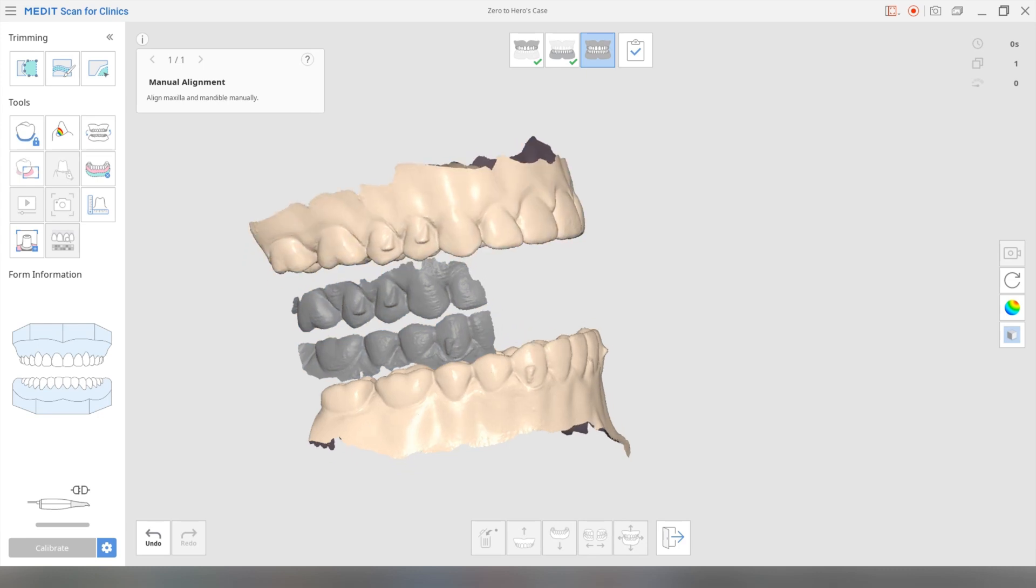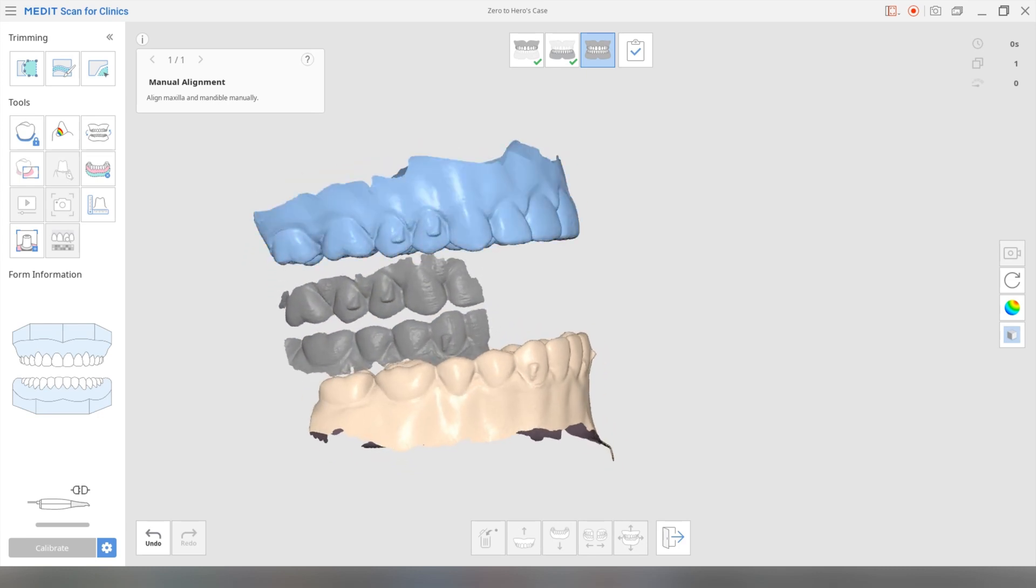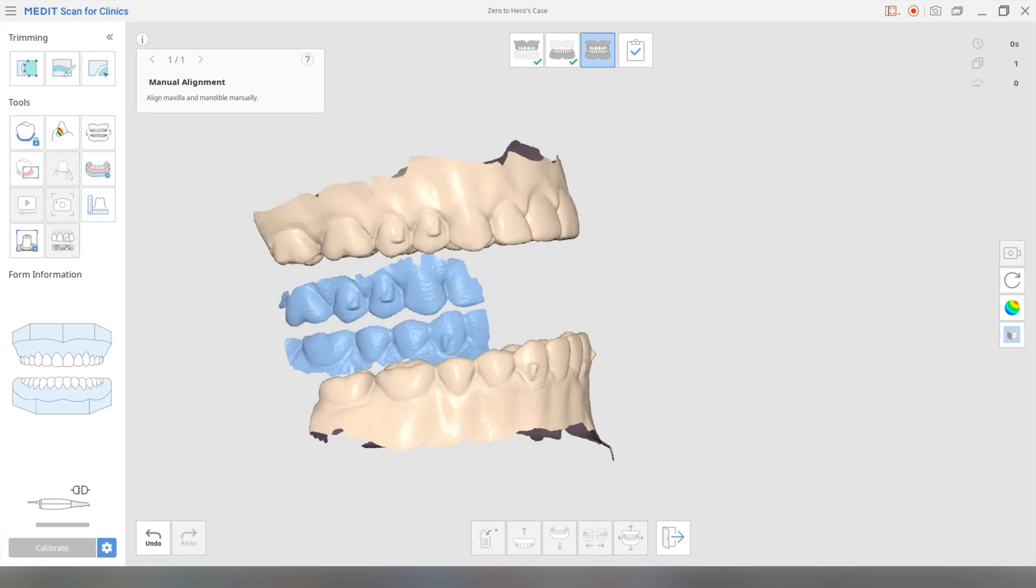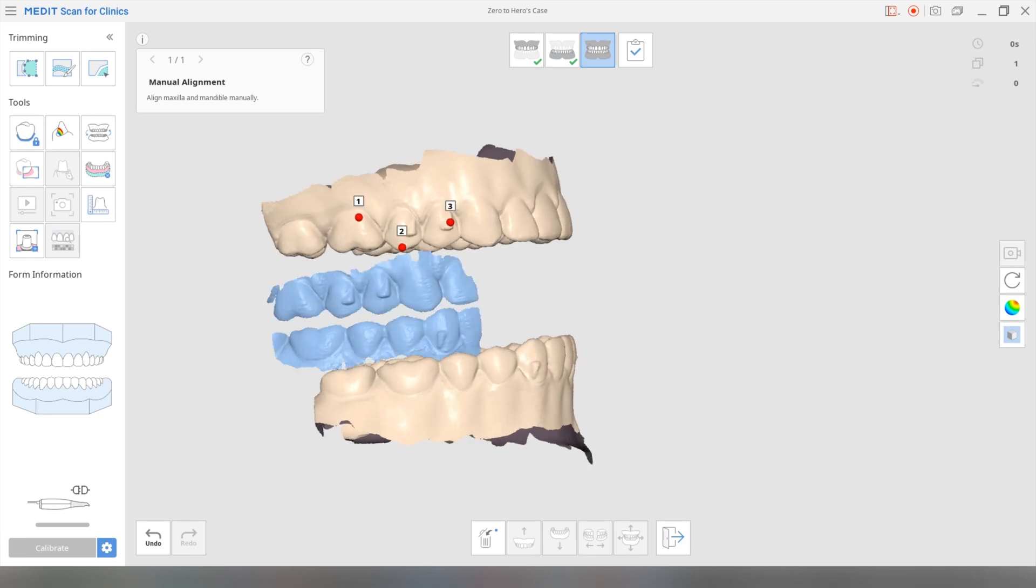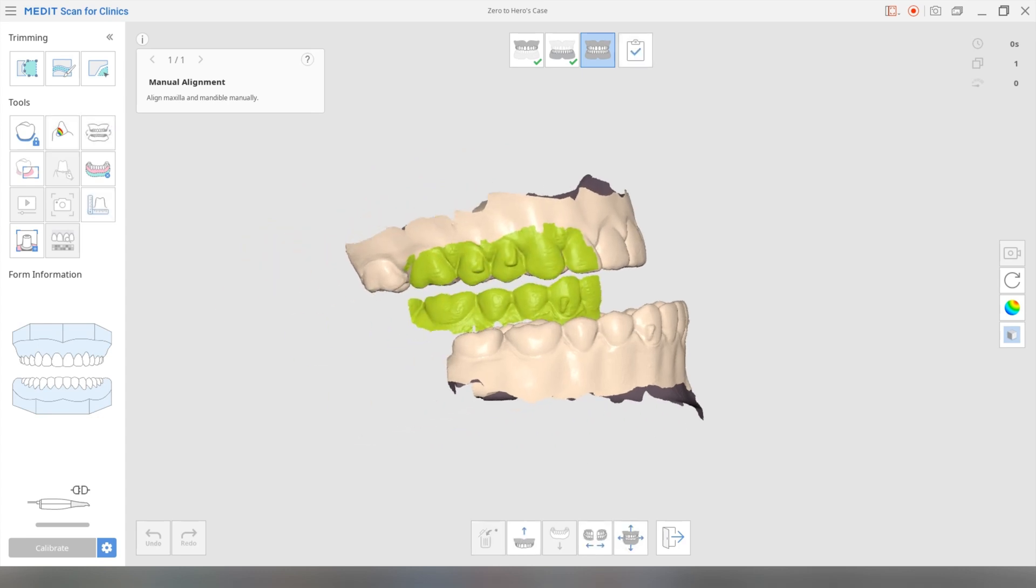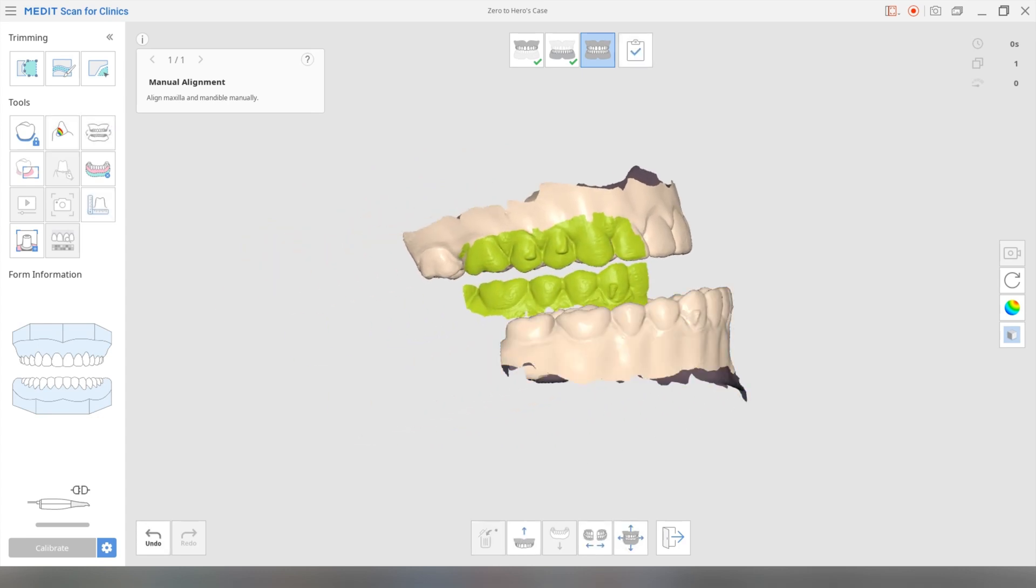So what you're going to do is you're going to put three markers on the top jaw, and you should do it on a triangle. So you should do one maybe on the six at the gingival margin over here, or as long as it appears on your scan. So I'm going to put one over here. I'm going to put one on the cusp tip of the five over here. And then I'm going to put my third one on this attachment. Then you're going to align it with this scan, the bite record. So number one, number two, and number three. And it aligns, and it aligns pretty well.